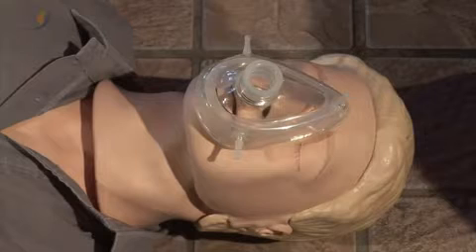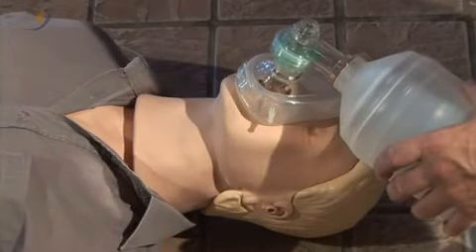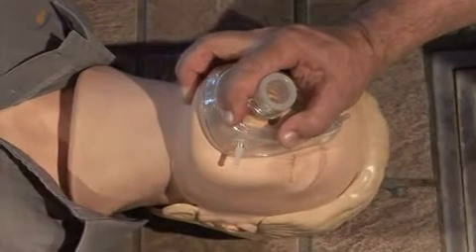The mask should cover the patient's mouth and nose, and should not extend over the patient's eyes. Place the mask on the patient's face with the apex or pointed end towards the forehead, positioning the apex over the bridge of the nose as a guide for correct placement.